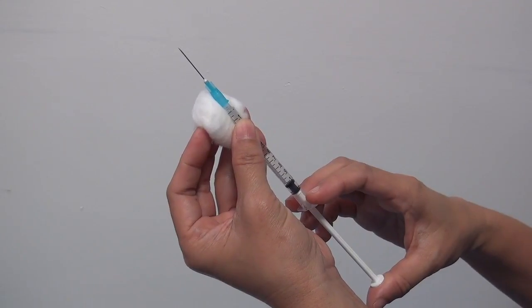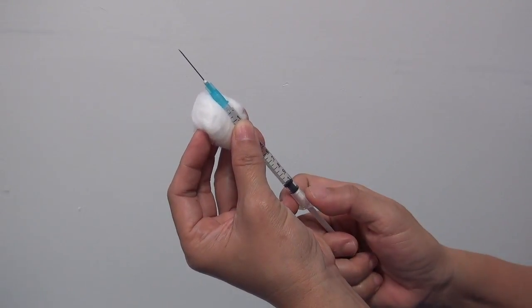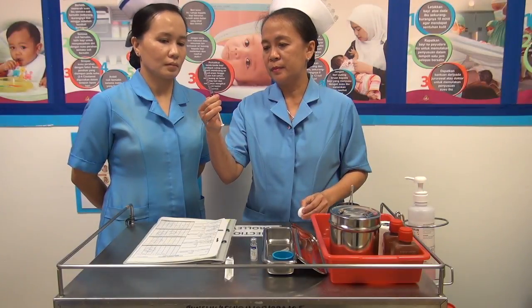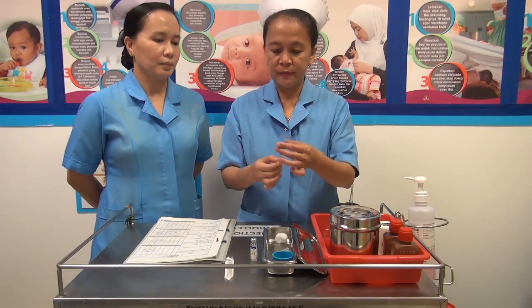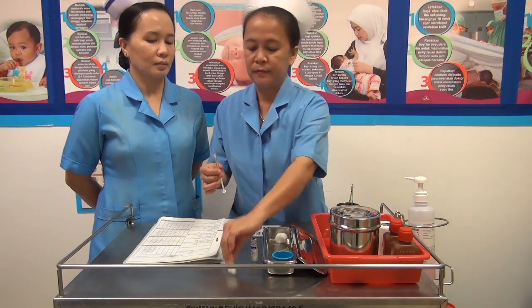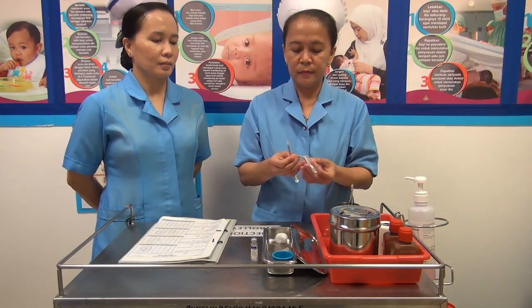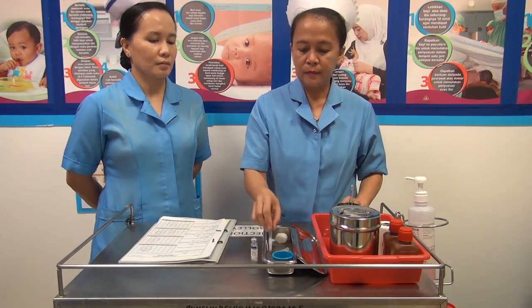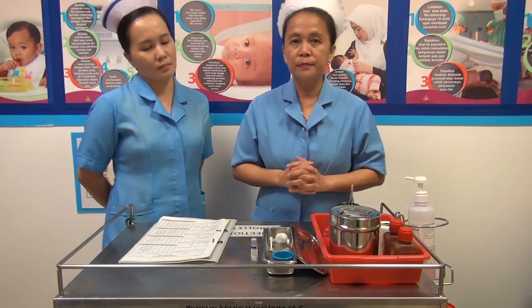Expel the air within the syringe and ensure that the dose is accurate. Confirm the dose with your colleague. Next, change the needle to a smaller needle, which is either a 25 gauge or 26 gauge needle, and fill the needle with heparin. Remember to dispose of the first needle accordingly.